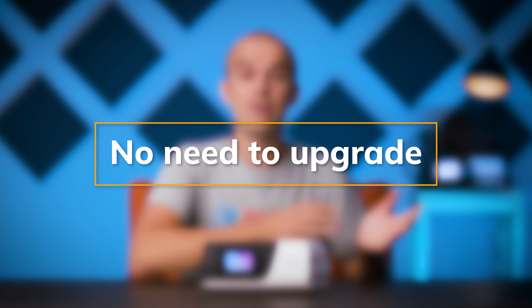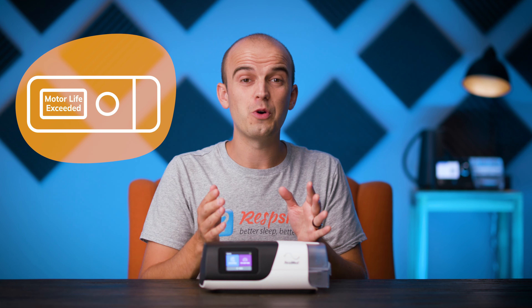Reason number four. If you're looking at the AirSense 11 to replace the AirSense 9 or 10 that has displayed a motor life exceeded warning, then I have good news for you. If your existing machine is working, you can safely ignore this message and keep using it. The warning is timed to display after a designated number of use hours. ResMed added this feature to prompt you to upgrade, and it doesn't necessarily mean that your machine's motor only has a short lifespan left. How considerate of ResMed. If your unit does still work, it still works, and if you still like it, you can still use it — so there's no need for you to upgrade.